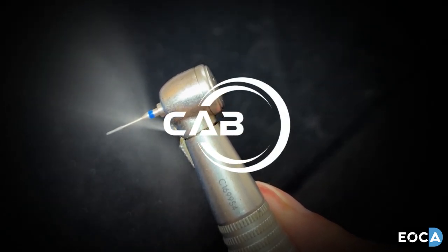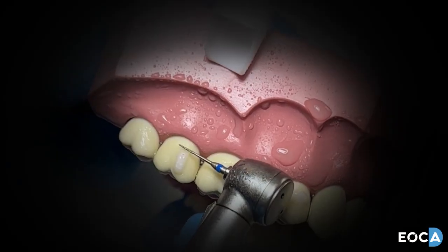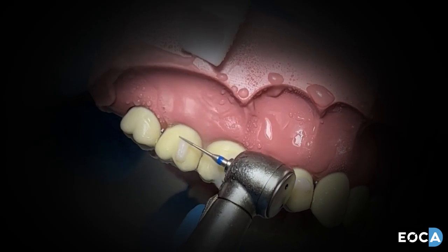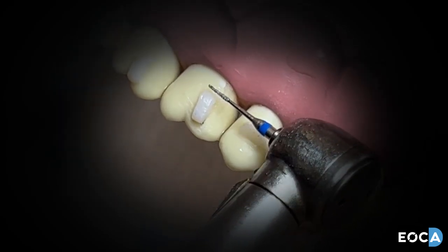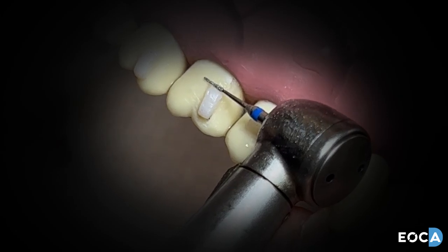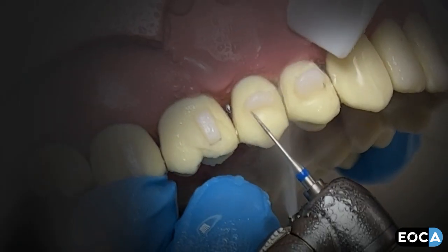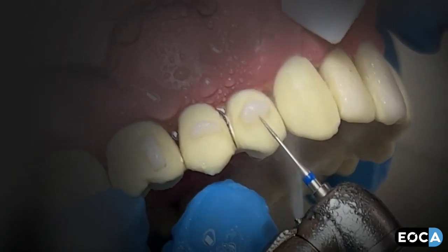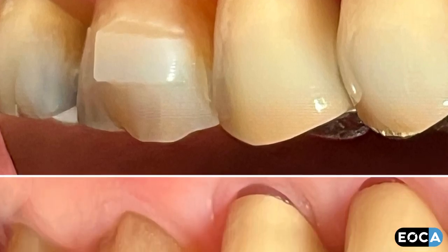Composite attachment finishing burrs are exquisitely manufactured fine diamond burrs specifically engineered to provide rapid and accurate removal of excess composite resin after placement of attachments associated with clear alignment therapy. They are equally effective in gently removing attachments with minimal enamel impact at the end of treatment. The diminutive size allows the user to easily maneuver the burr around even the most delicate attachment shapes.